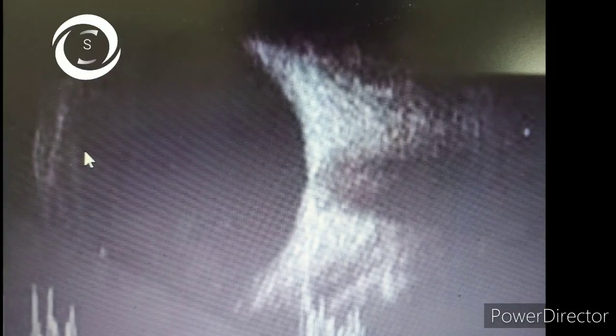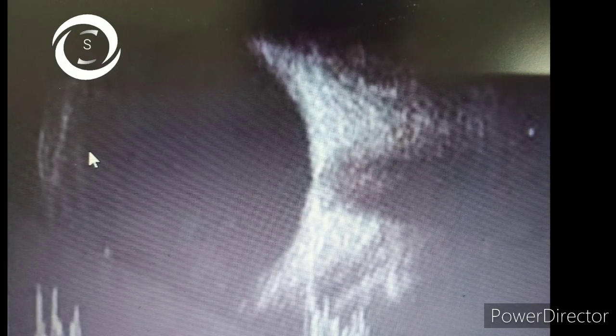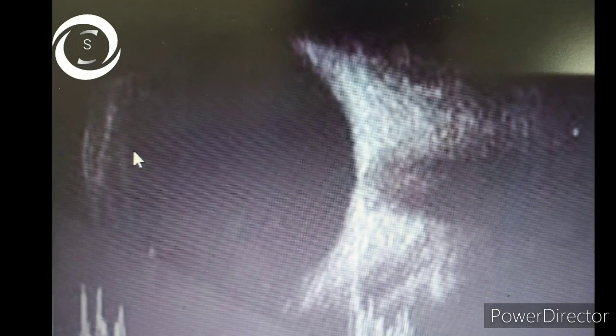This is also a normal B scan. Here the arrow points to the location of the lens. Structures in front of the lens are visualized by ultrasound biomicroscopy (UBM), and structures behind the lens are better visualized by B scan. The frequency is 10 to 20 megahertz. Now look at the size of the eye — whether it is unusually large; think of a siliconized eyeball or high myopia, and check for posterior staphyloma — or very small, as in hypermetropia, microphthalmia, or nanophthalmos.